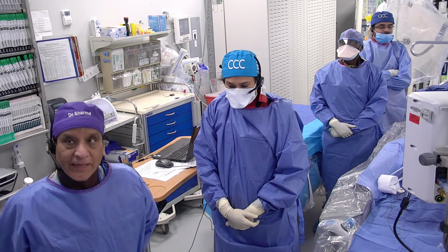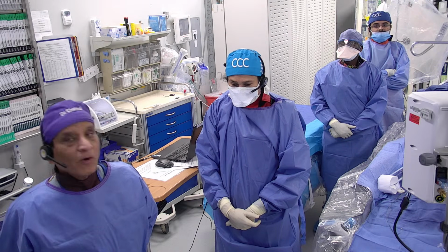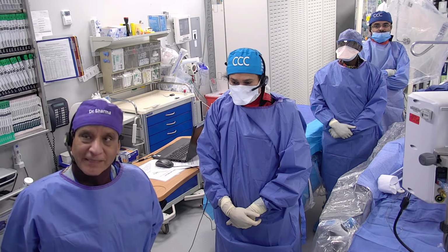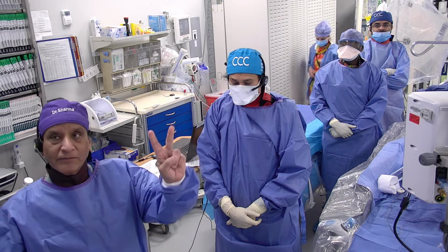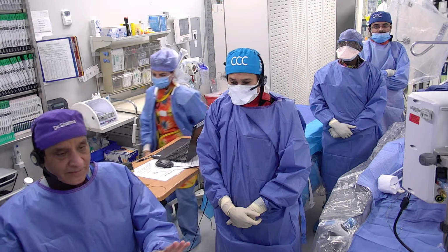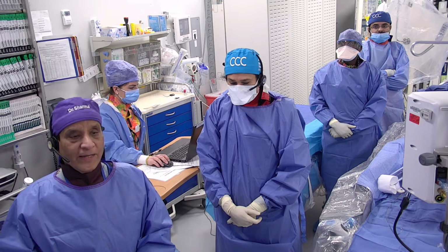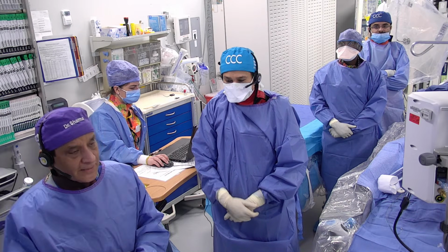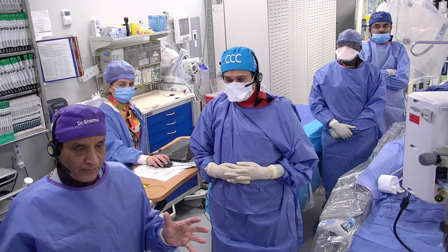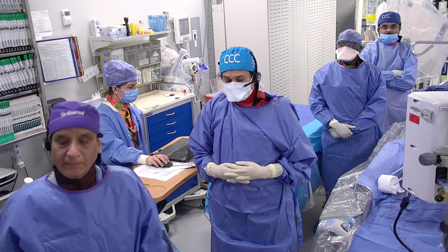The second point, in America, RECOVER IV is a trial for cardiogenic shock, the same concept as DanGer Shock. So whether it should be in every lab, I think let's wait one more, because we have 2 negative trials of ECMO and 1 positive that just came out with this impeller. So it's reasonable to wait for the RECOVER trial, maybe the data will be out by mid next year or next ESC, about 1 year more, before we mandate that every lab should have an impeller. I can tell you, I have 6 labs in our periphery, 3 of them have no cardiac surgical backup, and I mandated that every lab should have an impeller.